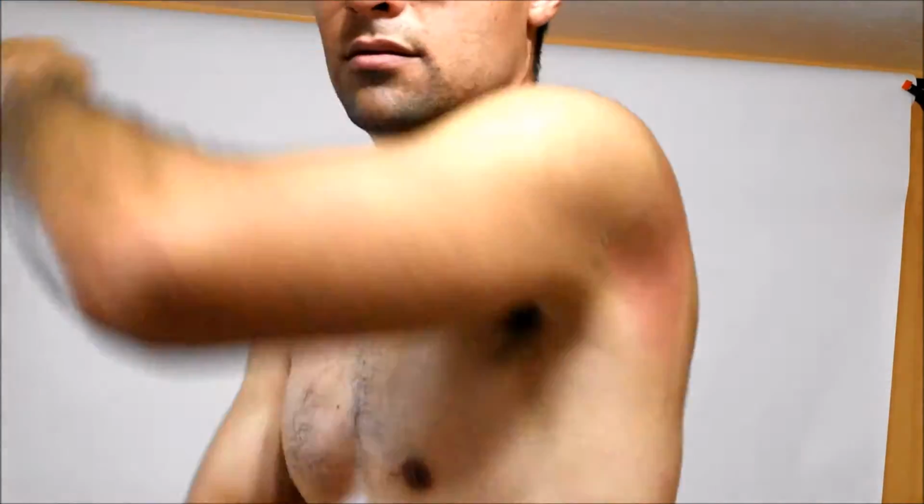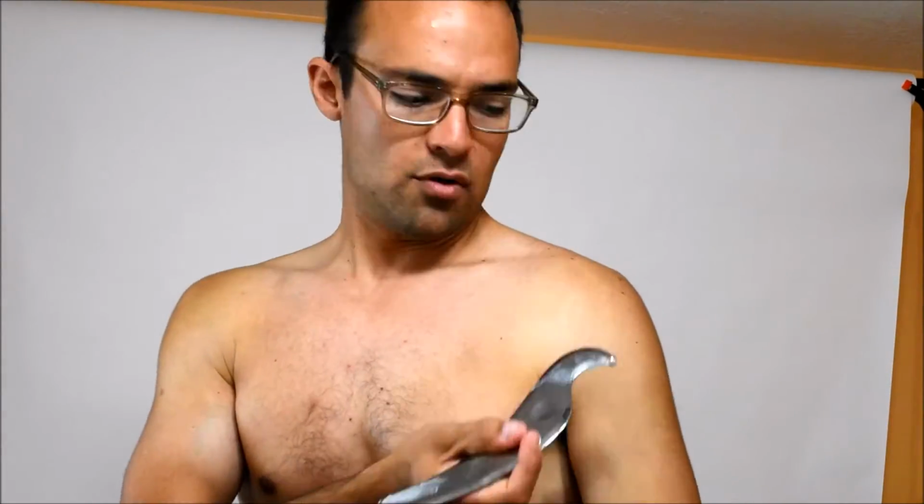It's good. Now if the adhesions or the issue is found on the anterior shoulder, you're going to want to focus more on delts right here, or pecs, right? Pec minor, pec major. Pec minor's deep, but that's pretty much the gist of it.